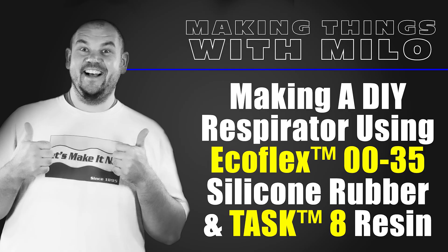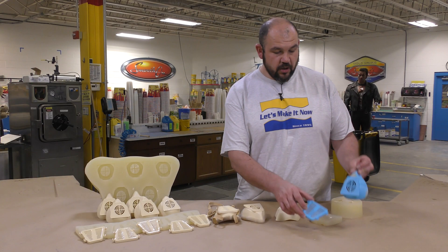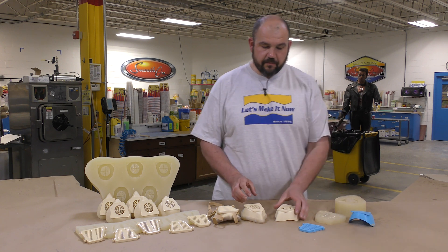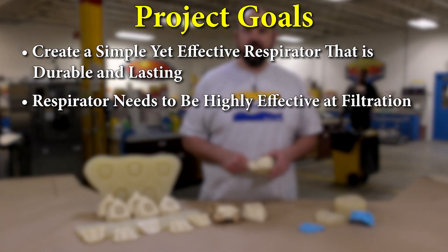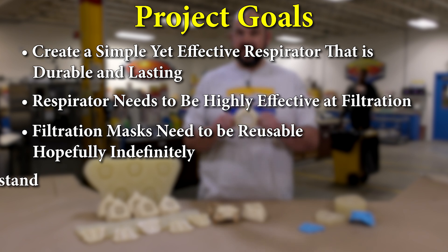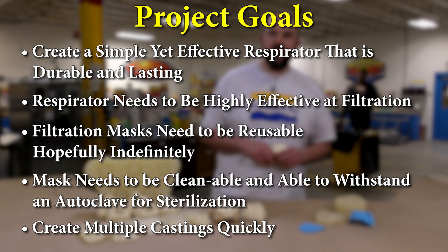Making a DIY respirator using the Ecoflex 0035 silicone and the Task 8 casting resin. Today we're going to show you how to use a simple 3D print of a respirator to make a block mold that's very soft and stretchable. That's going to allow us to create multiple models which will lead us to make a gang mold. Our project goals are a simple respirator design with a good flow ratio, a reusable model that can be sterilized using an autoclave, and the ability to make multiple castings quickly.